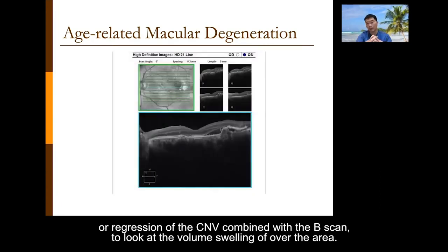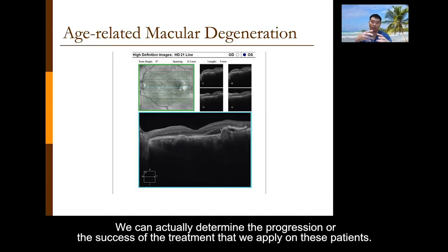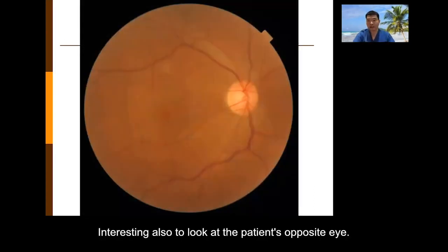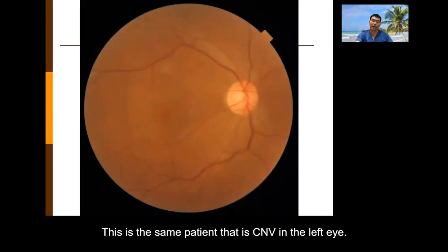Combined with the B scan to look at the volume as well as the thickness or the swelling over the area, we can actually determine the progression or the success of the intravitreal treatment or whatever treatment that we apply on this patient serially. Interesting also to look at the patient's opposite eye. This is the same patient that has CNV in the left eye.